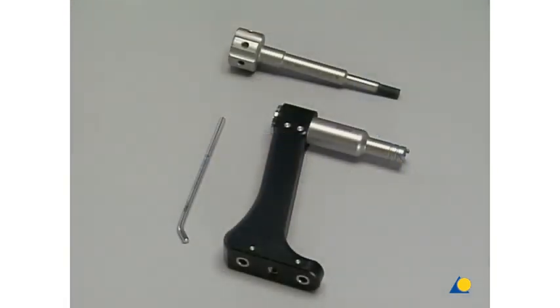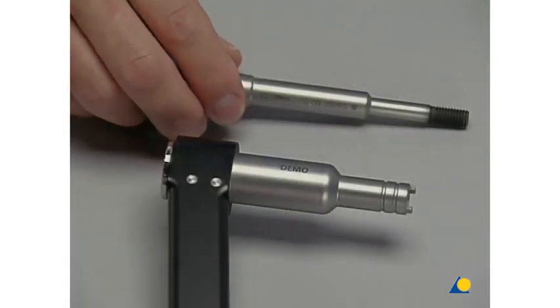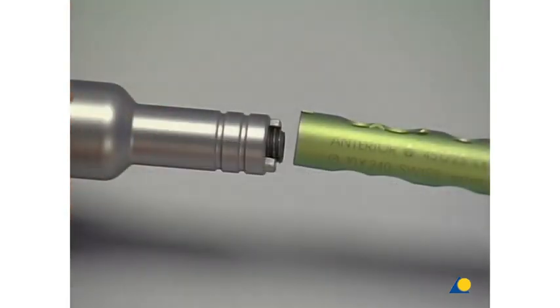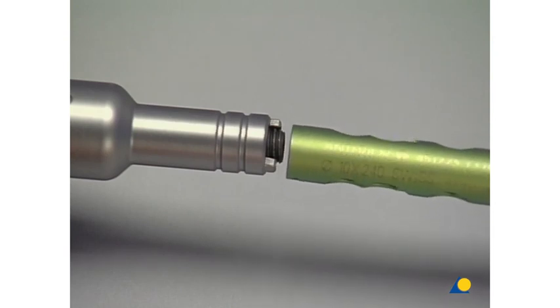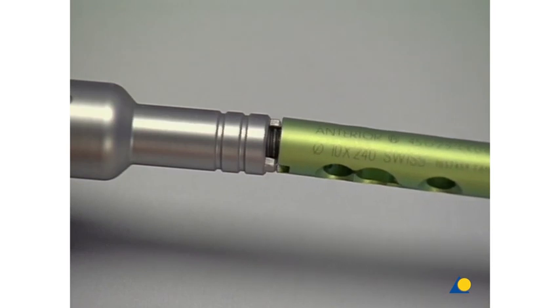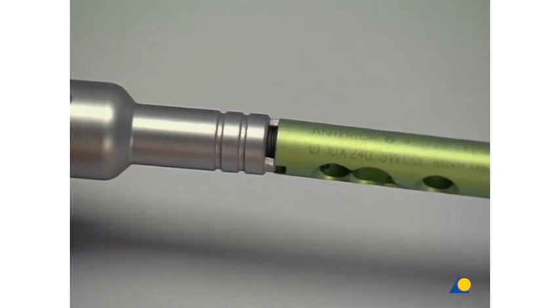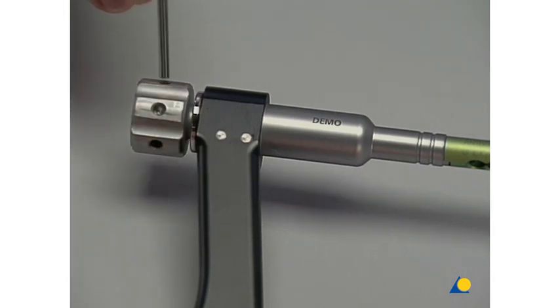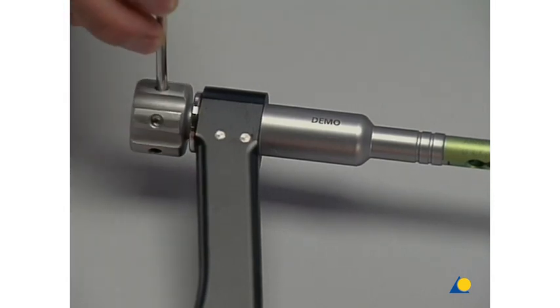To mount the insertion handle onto the nail, the connecting screw and the pin wrench are used. With the insertion handle facing laterally, the connecting screw is inserted, and the teeth on the handle are aligned with the corresponding notches in the nail. The curvature of the implant must be aligned with the anterior curvature of the femur. The inscription anterior on the nail helps avoid confusion. The connecting screw is then tightened with the pin wrench.